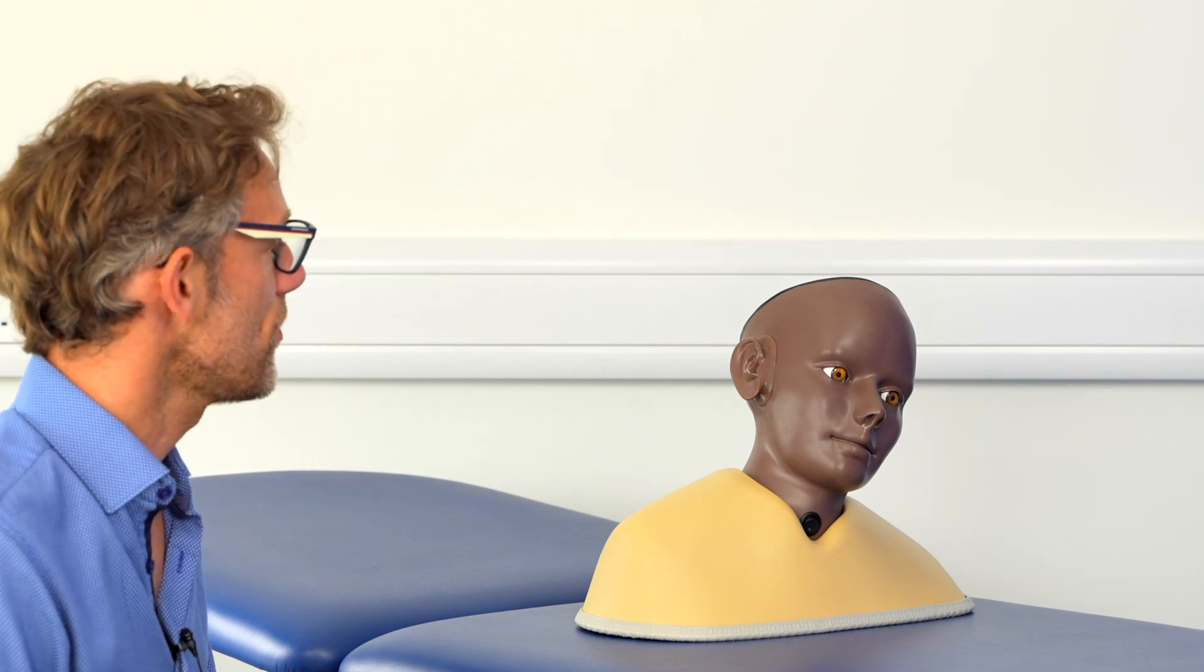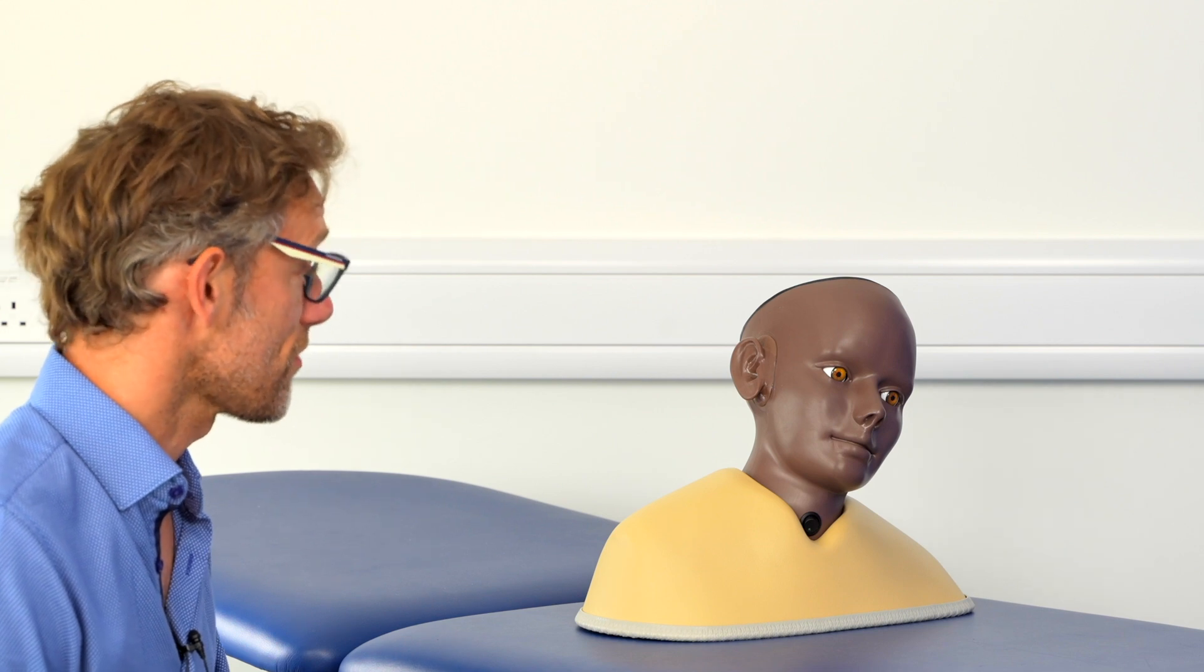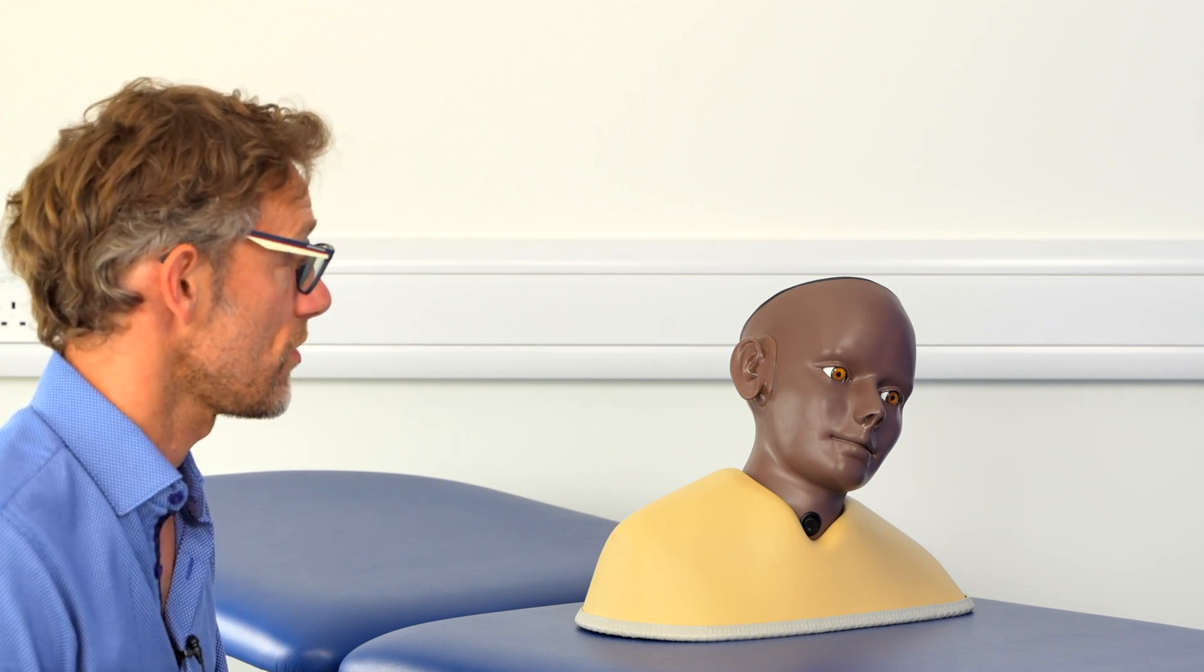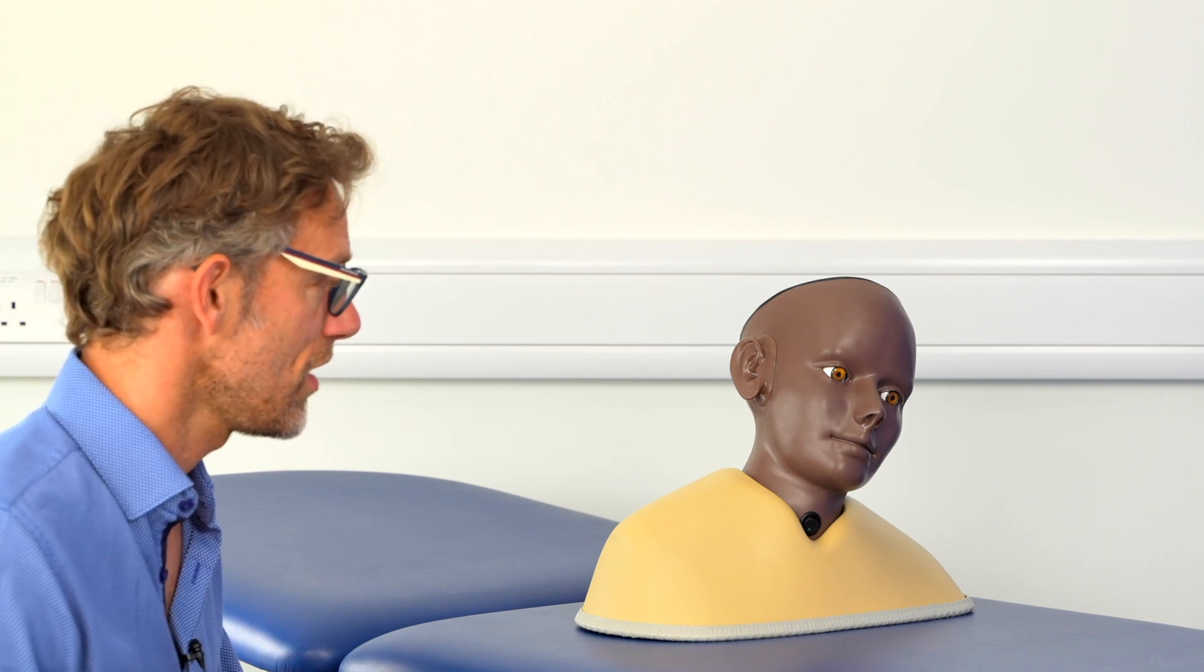Hello, my name is Dr. Gill. I've been asked to assess your ears today. That's going to involve having a look at your ears, pressing around your ears, using an otoscope to look within your ears, and also doing some hearing testing. Are you happy to proceed with that? The patient provides consent, so thank you.